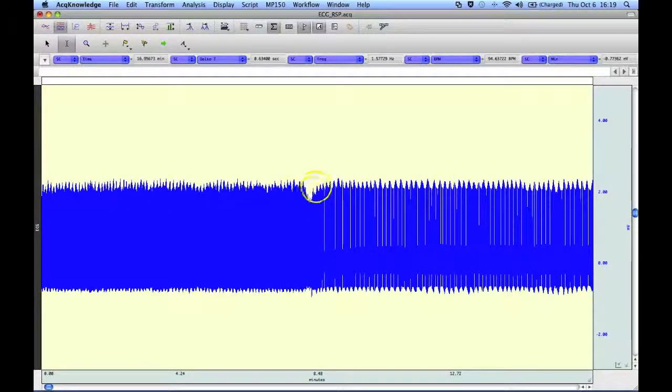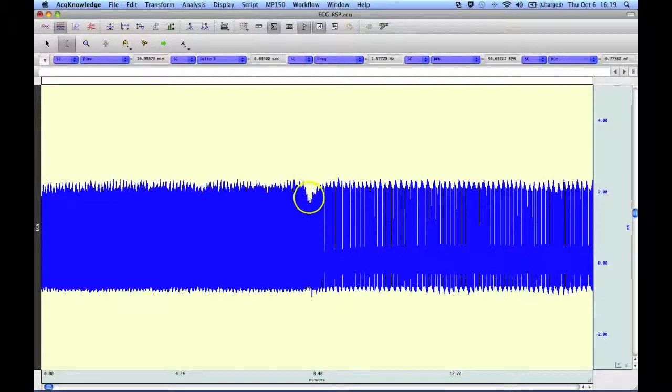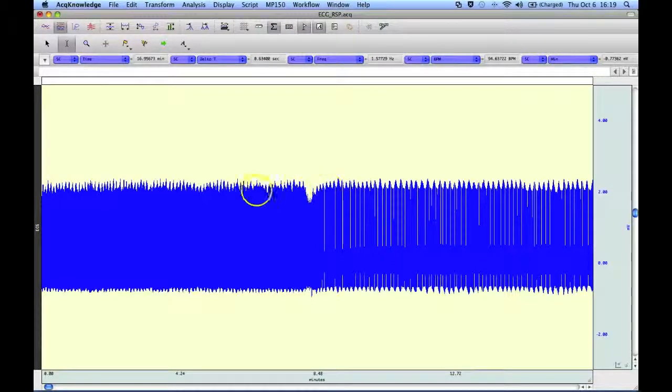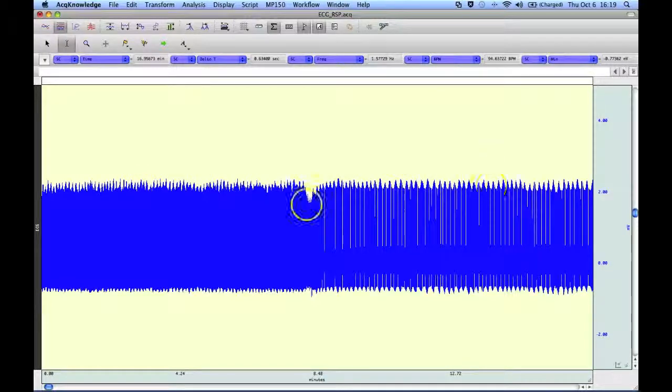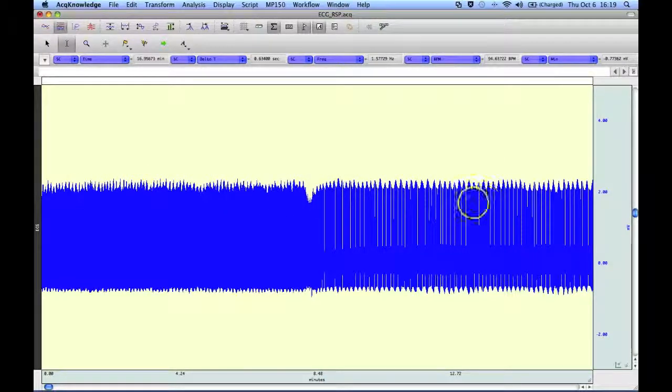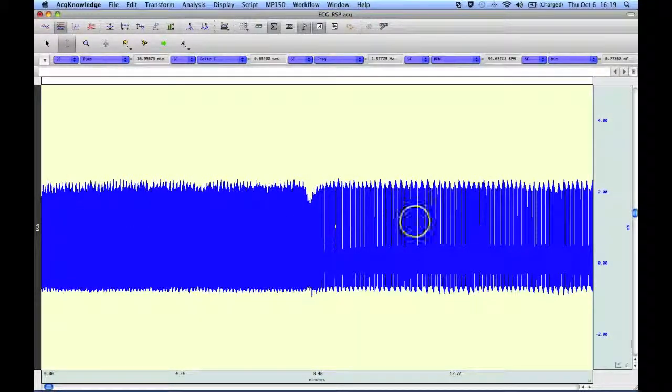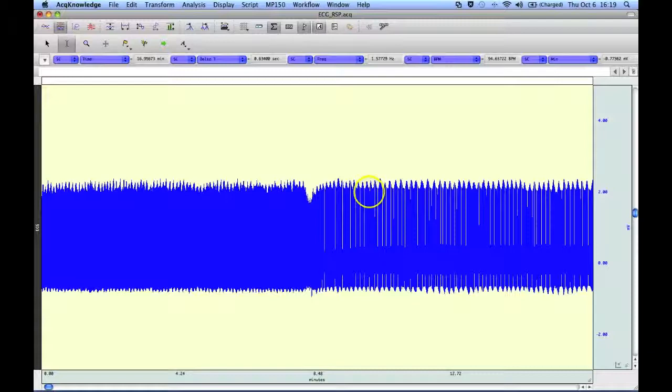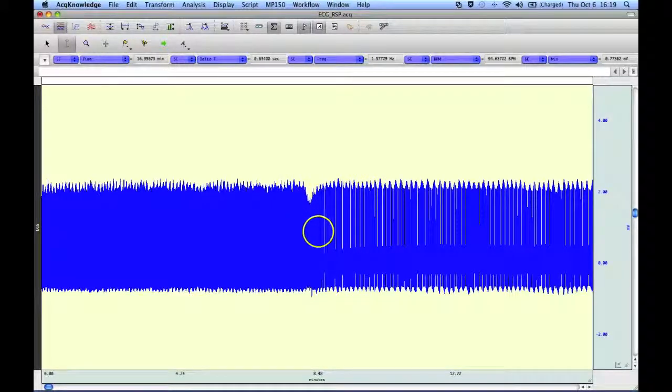And this is where we were looking at in the waterfall plot, where we were seeing that change. The subject changed position during the recording, and you could just see that in the plot.